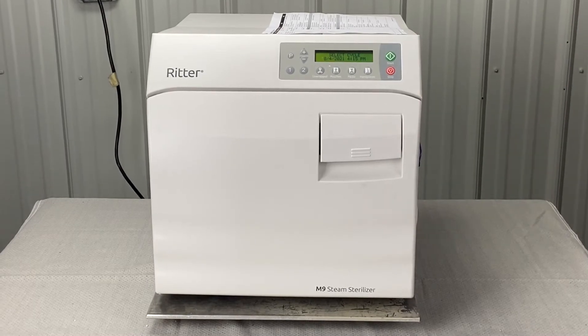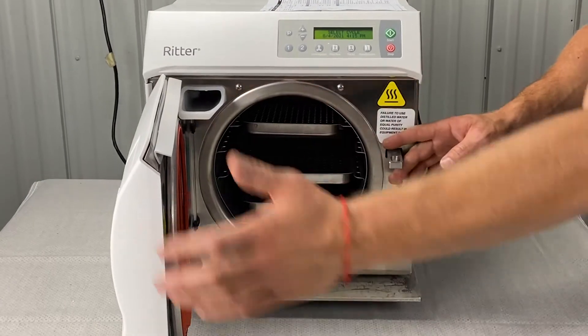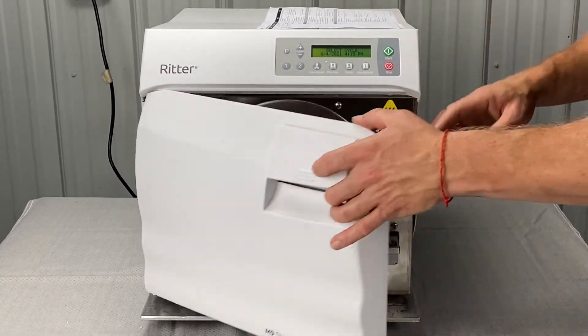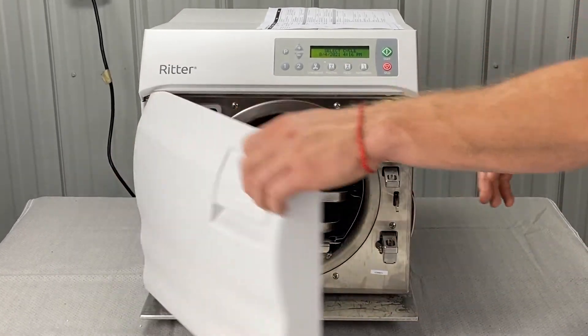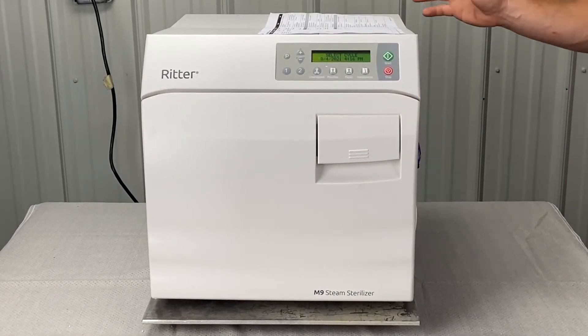We also want to pull all the instruments out and run an empty cycle. Make sure the unit was not overloaded — that's the first thing we'll try. Pull all the instruments out, all the trays out, let it cool down for five minutes, shut the door, and run another load. If you get 982 again, we're going to dig a little bit deeper.